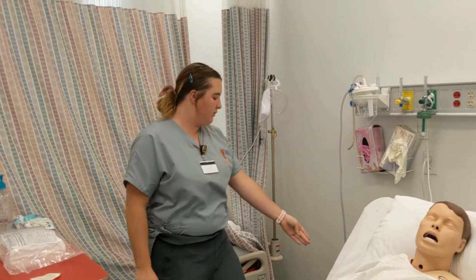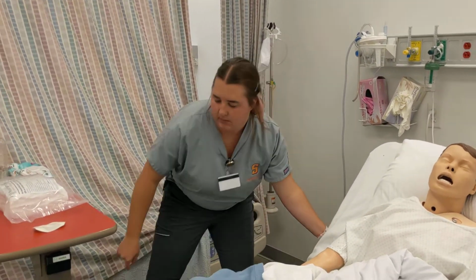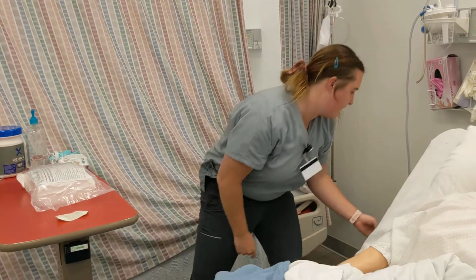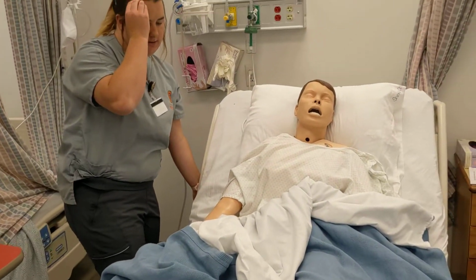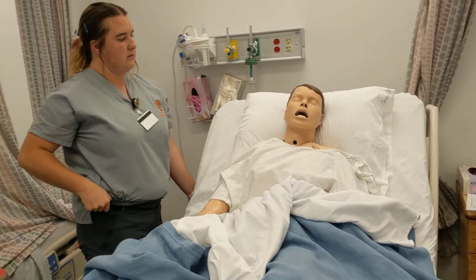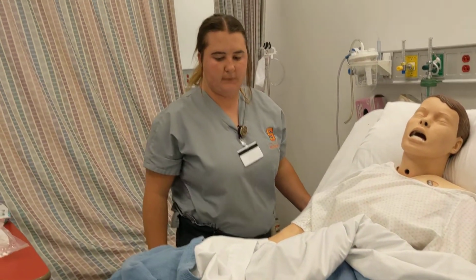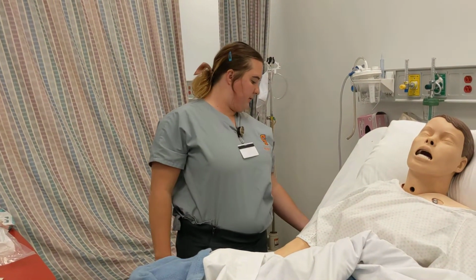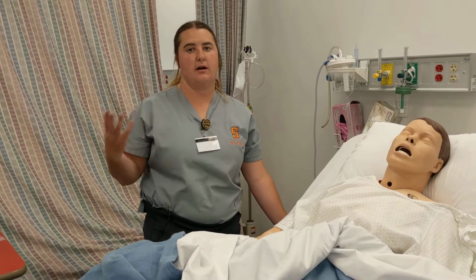So first what I'm going to do, I'm going to raise the patient up to a working height for me. Oh, garbage can's going to fall. All right, so I'm just going to move the patient to a working height. Okay, so I'm going to put the patient's head down. Just make sure that they're comfortable.